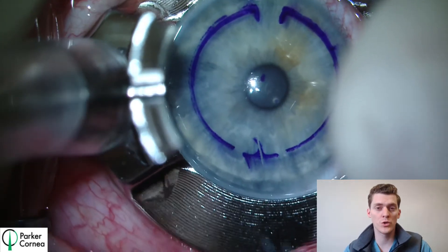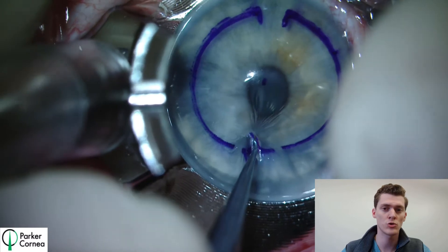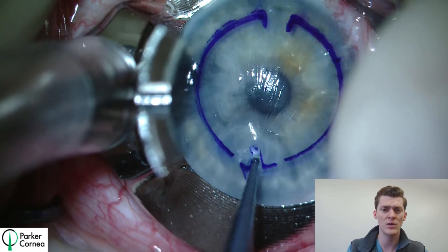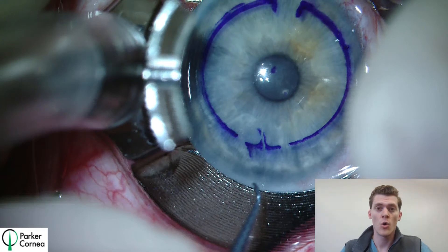As you can see, we've already marked the cornea, made the radial incision, and applied suction. So our next step is we're going to open up a small stromal pocket using what we call the long Sinske hook. During this process, we see an outpouring of aqueous onto the corneal surface, indicating a perforation. So the first thing we need to do is stop and decide what should we do.